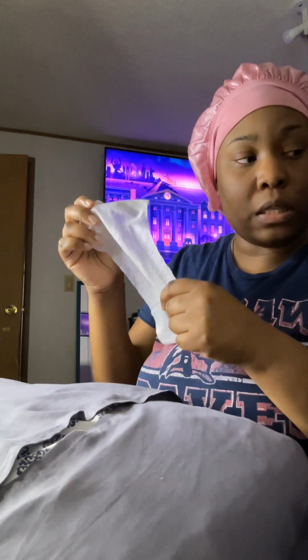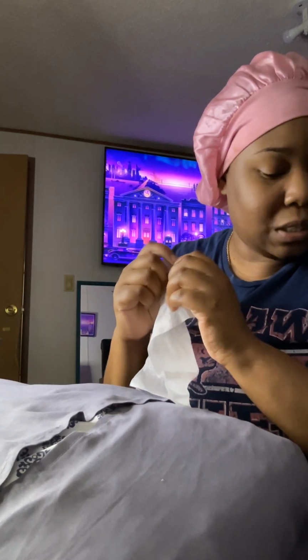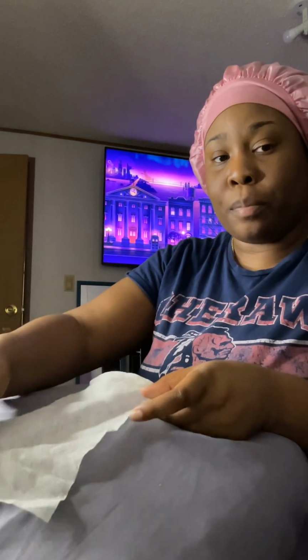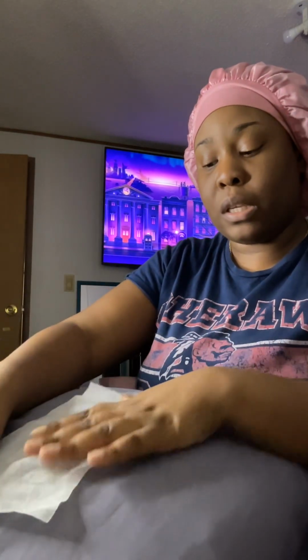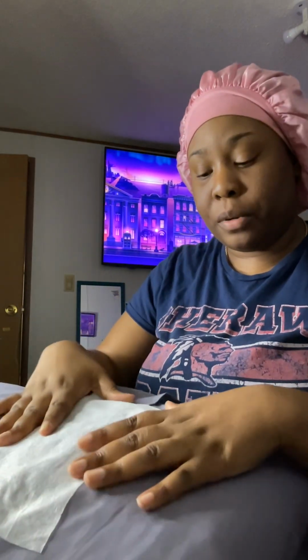I had tape when I started this video, my tape just magically disappeared, so I don't know where my tape is at. So we're going to put the dressing right across here. And if I had tape, I would have taped it down, but I don't have any tape. So we're going to put the dressing right here. And this is how it will look.